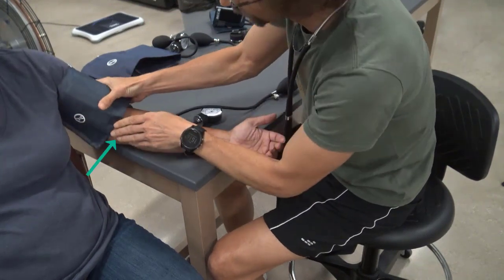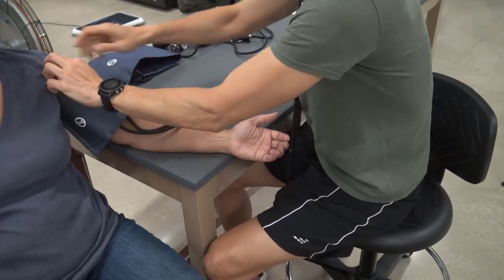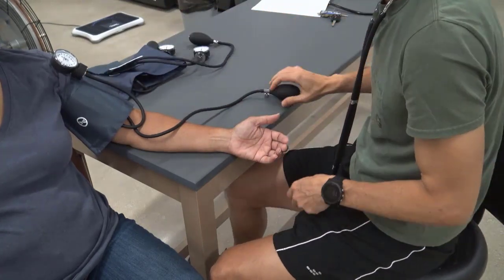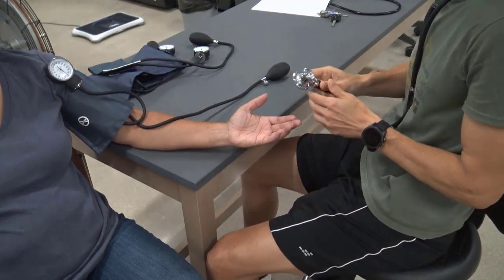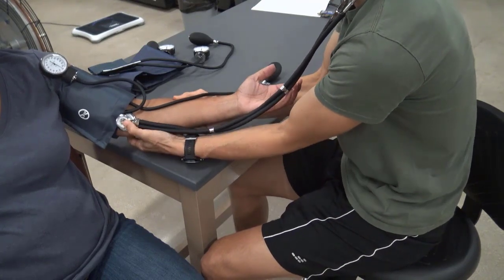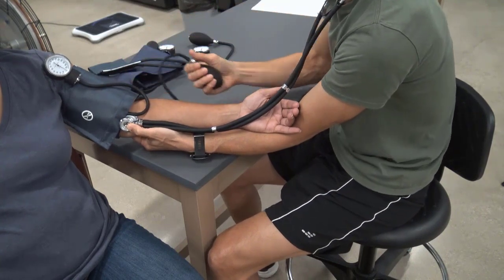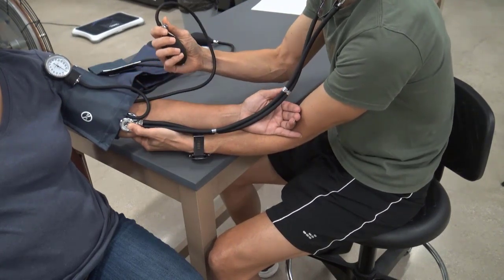Note the position of the cuff in relation to the brachial artery. You can then clip the aneroid gauge to the cuff, have the patient hold it, or clip it to the patient's sleeve. The arm should be covered with about 80% of the cuff bladder; if it takes more than this, a larger cuff is needed, and if it takes less, the smaller cuff is needed. Once you have the cuff and gauge in place, cradle the arm under the elbow as this will keep the stethoscope in place. Use your right hand to close the valve and be sure not to over-tighten it — it just needs to be tightened until the knob stops turning.